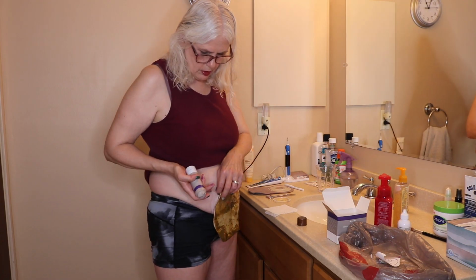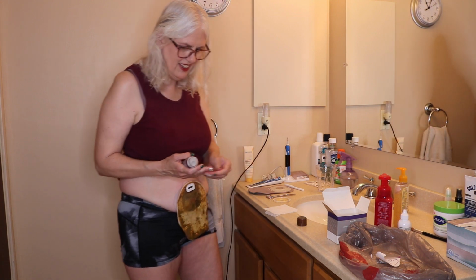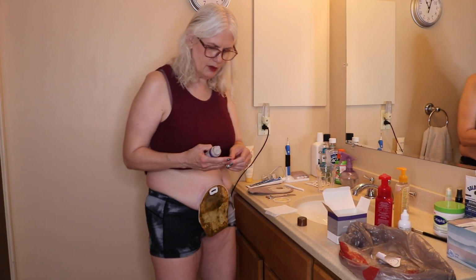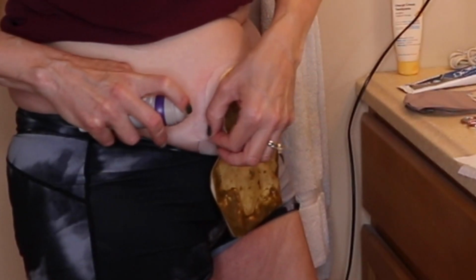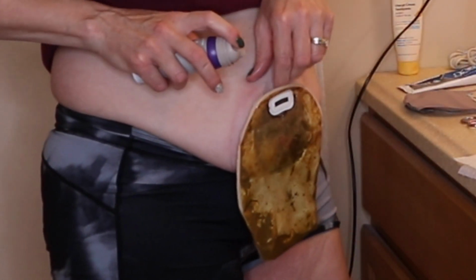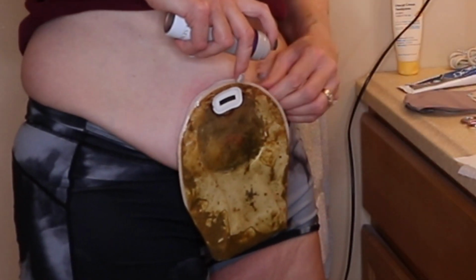So I will spray with the adhesive. Oh, I've got marker all over me. This is more of a slippery type of covering on there, again, than the other bag. It's more of a sticker, so I'm gonna have purple fingers. Anyways, to remove, you just kind of pull this off, but you want to do it gently so you don't hurt your skin at all.